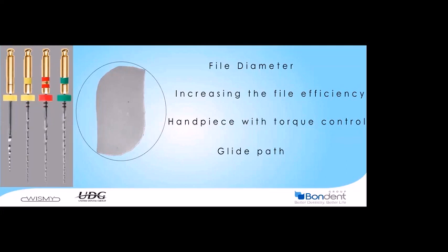And this file is designed to work the apical part and the middle part of the root canal. If we want to increase the apical diameter or we want to increase the taper of the preparation, we are going to use the 25 06 up to the working length. So this file is designed to increase the size and the taper of the preparation. And the last file of the system is 35 taper 04. This file is designed to shape only the apical part of our preparation.